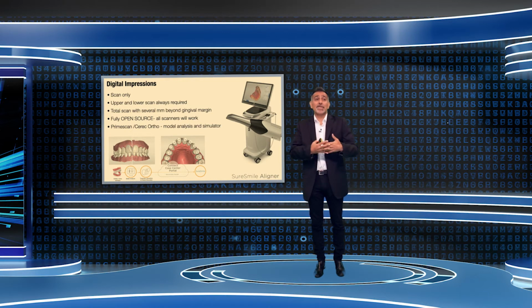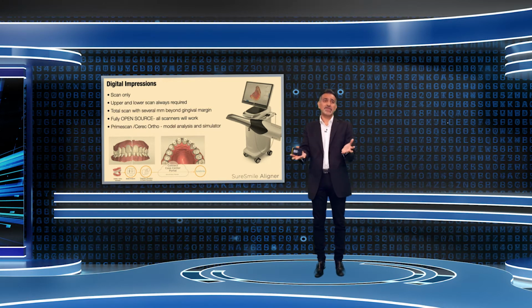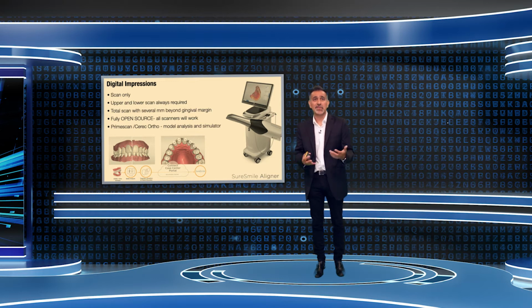Obviously, it's also fully open source, and that's great. So that means it will work with any scanner. You're not tied to a particular system. But if you've got something like PrimeScan or CEREC, you also have the benefit of the model analysis software and the simulator, all of which are really nice. But the most important thing is, as mentioned, it will work with every system.